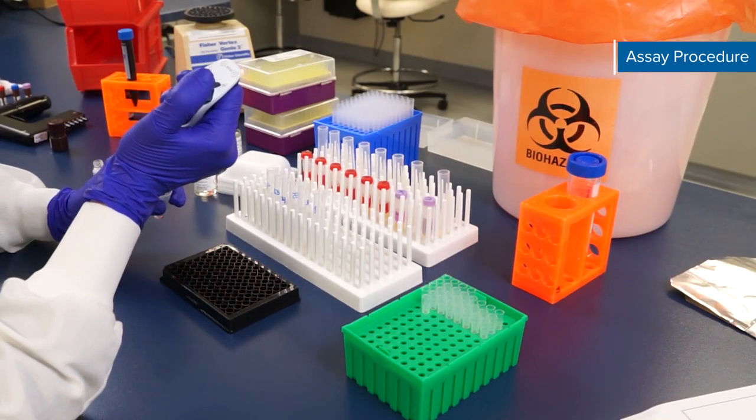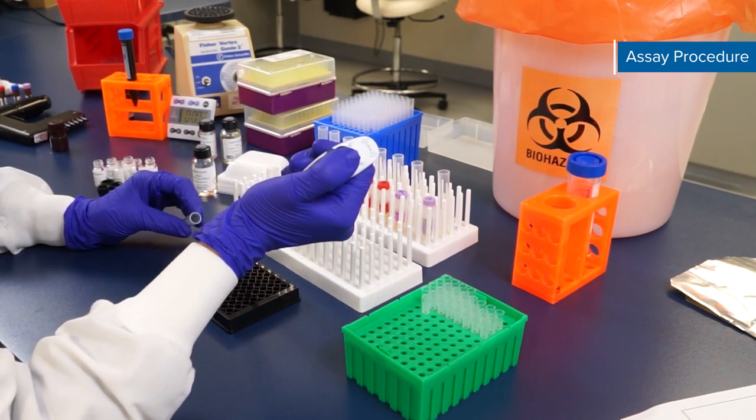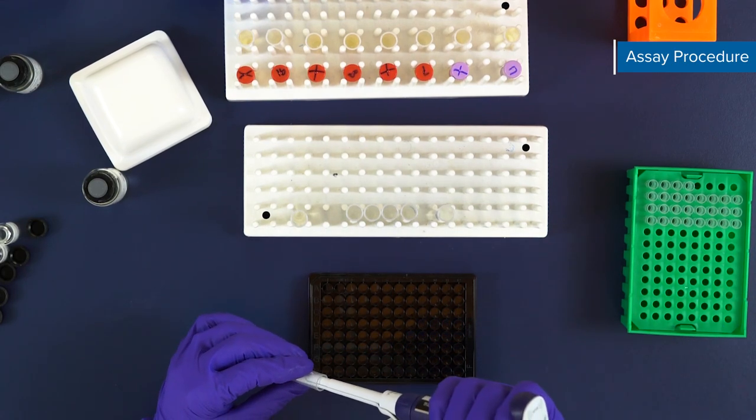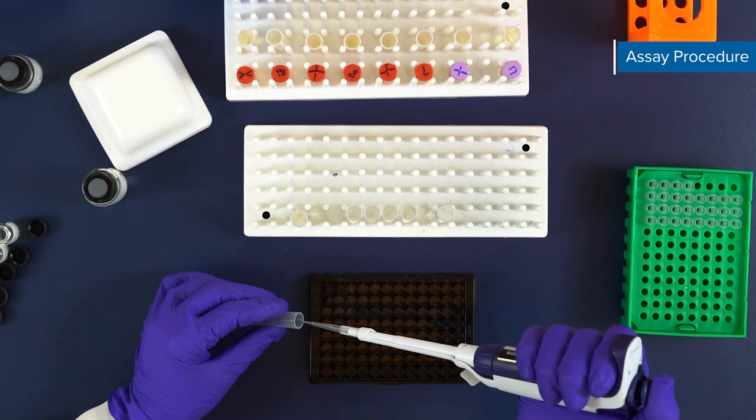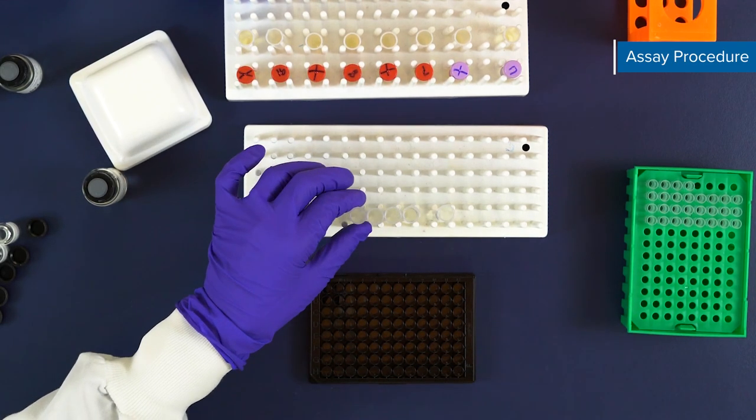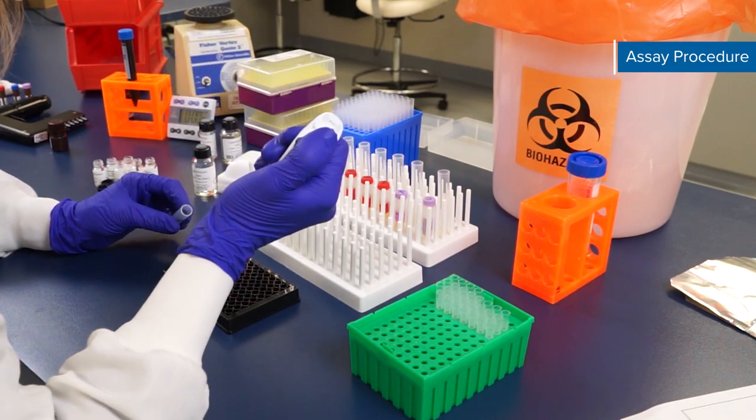Once you've prepared all reagents, standards, samples, and your instrument as directed by the kit booklet, it's time to load the plate. We recommend that all samples and standards be assayed in duplicate. During the assay remember to protect the diluted microparticle cocktail and streptavidin PE from light. First add 50 microliters of standard, sample, or blank per well.